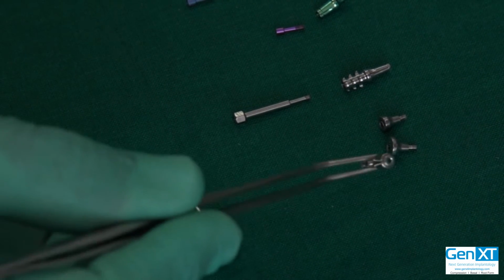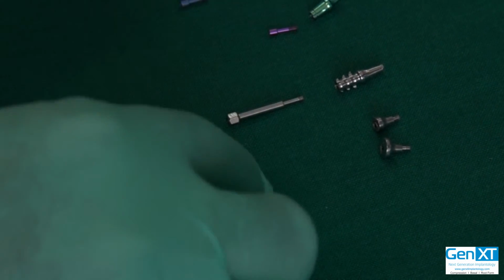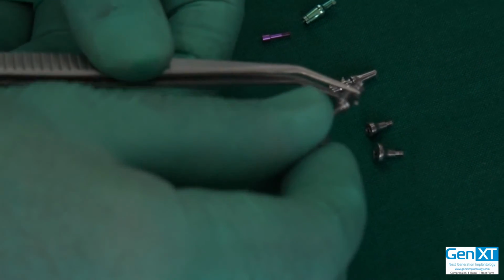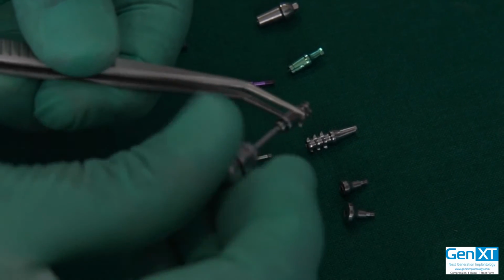So anyways, now you have placed the implant. Now the time has come for second stage uncovery. So you have done the exposure. You can use whichever technique you like. There are also punches available, or we can take an incision, which is the better way now to preserve soft tissue.